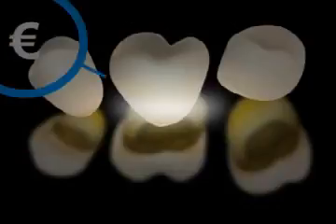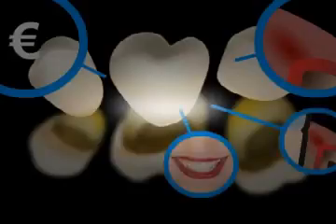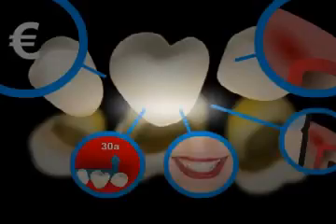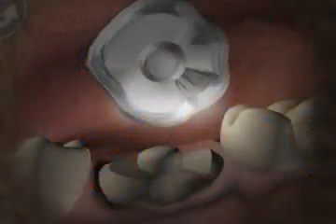There are many other details which go into making a good crown, but the working methods described here clearly show why the quality, and therefore the price, can vary so much. A good crown doesn't cause inflammation or retreat of the gums. It's indistinguishable from the original teeth and lasts for decades, and even if it needs to be replaced, the underlying tooth stump is still in good shape.